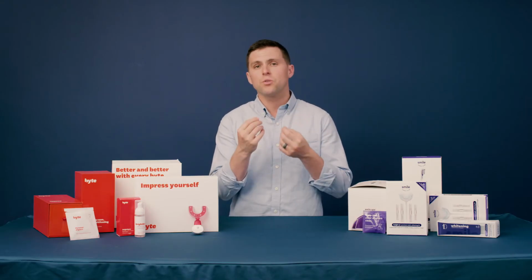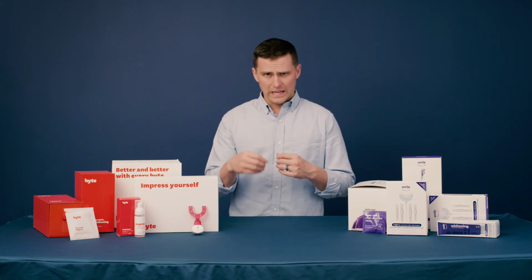And obviously I don't have an Invisalign aligner with me right now. You have to go through your doctor to get one of those, so we weren't able to get one in the studio today. But something to consider, they have an interesting feature called Smart Force that is an attachment that actually goes onto an individual tooth, and it helps with the whole alignment process. When you insert the aligner, it helps keep everything more straight, and they claim it's a better experience for the user.